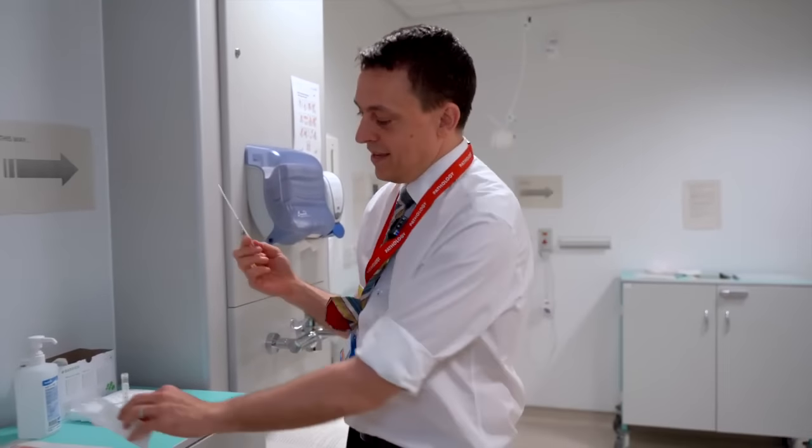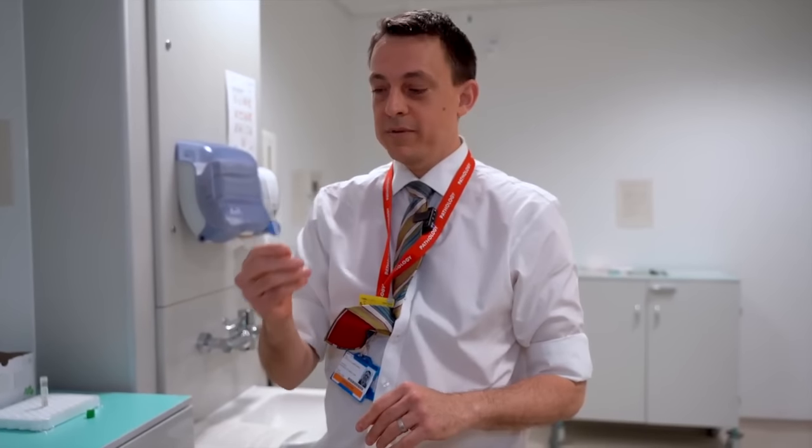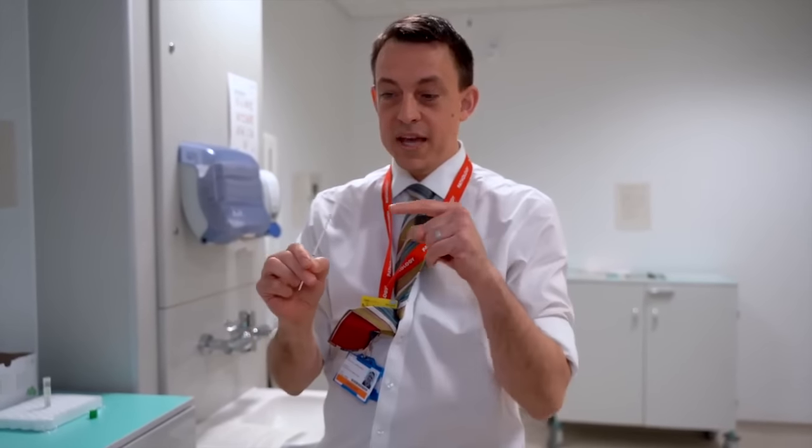Next, it's time to do your swabbing. We need a deep swab of both your throat and your nose using just one swab. The idea is to get the cotton tip at the end on both tonsils and then right to the back of your nose.